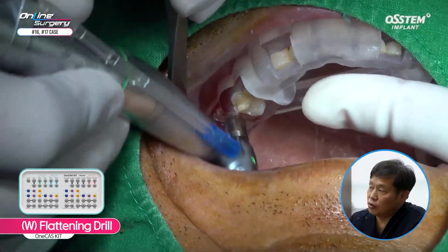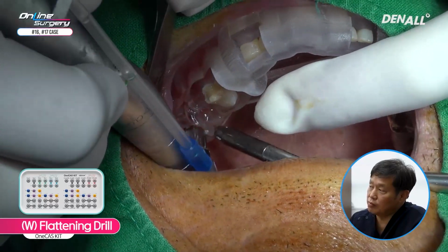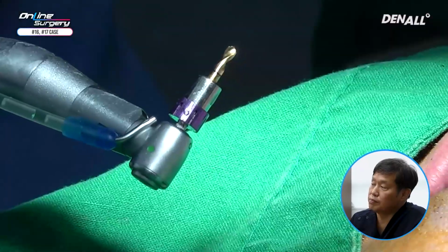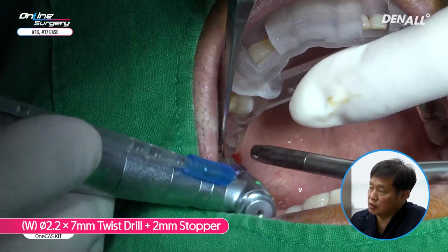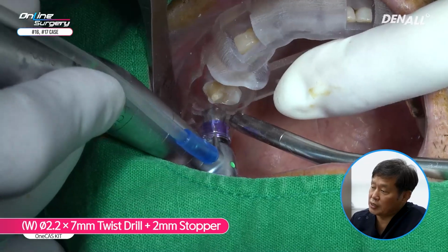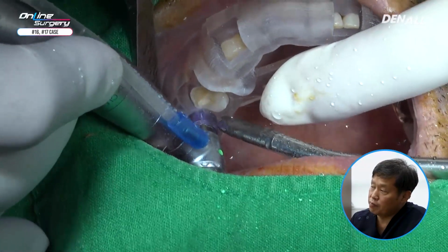Flattening drill is used from number 16. Number 16 and 17. 6 millimeter was assumed, so 5 millimeter drilling is done first. 7 millimeter with a 2 millimeter stopper. So initial drilling is done up to 2.2 using 5 millimeter.